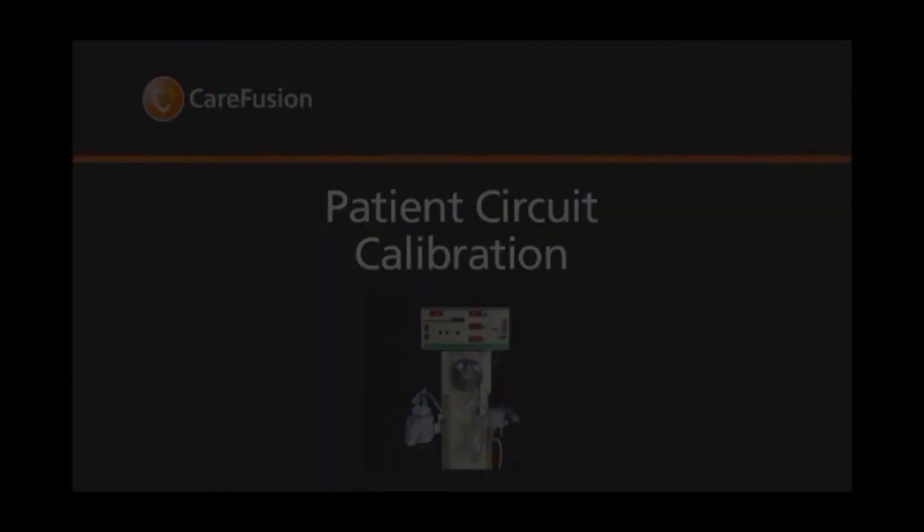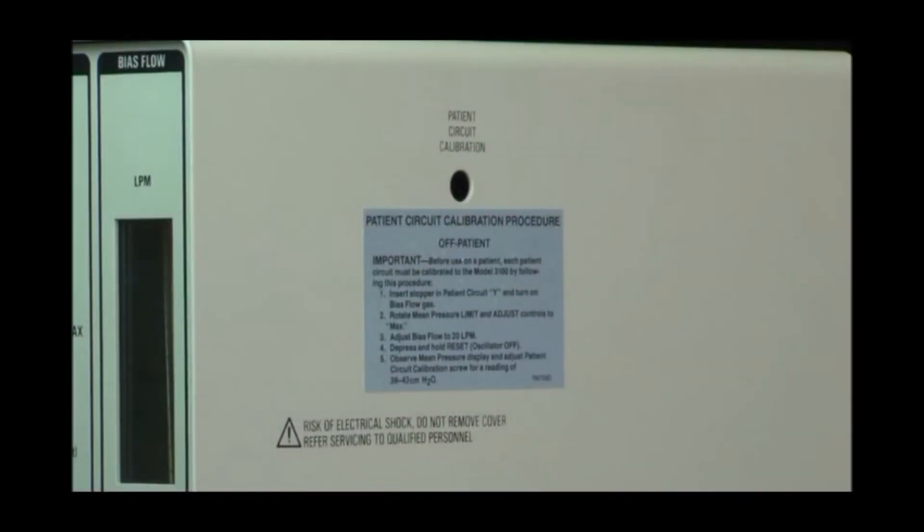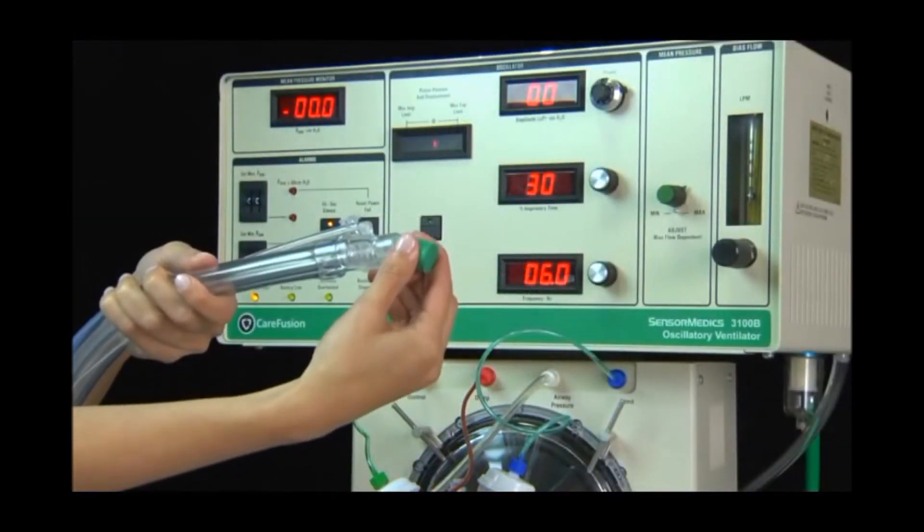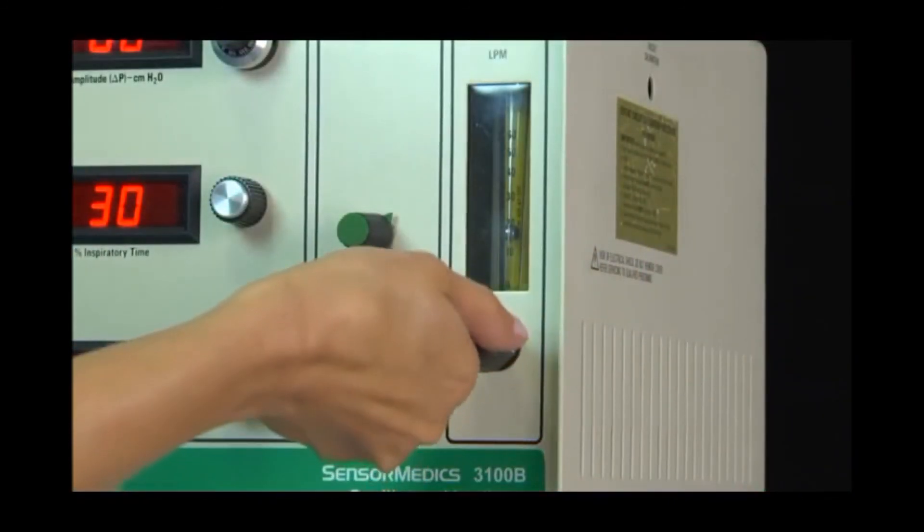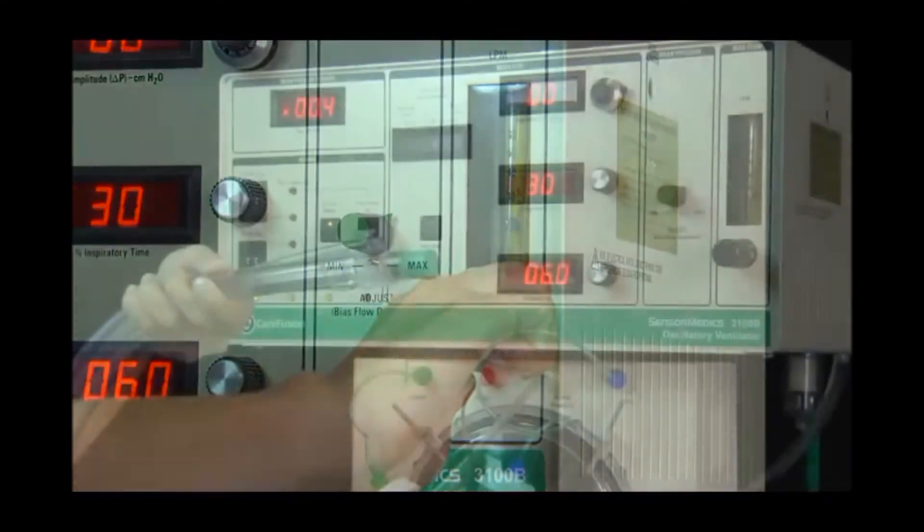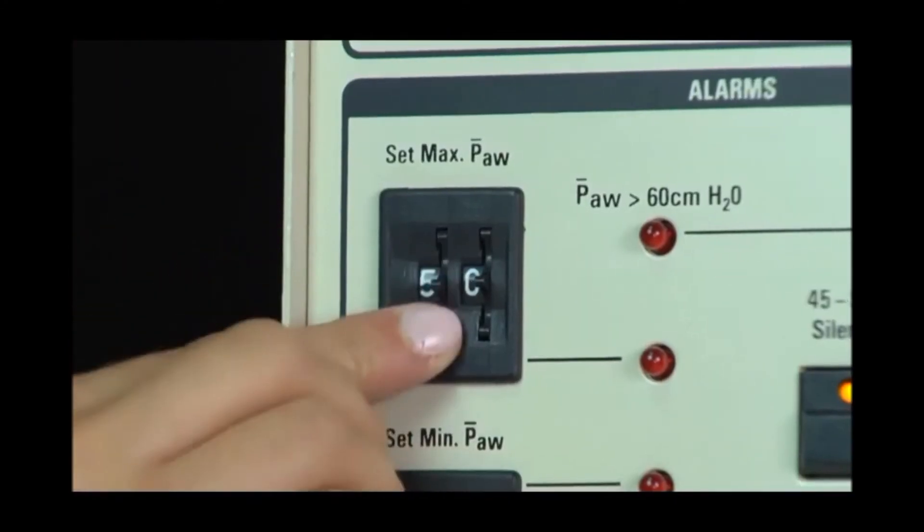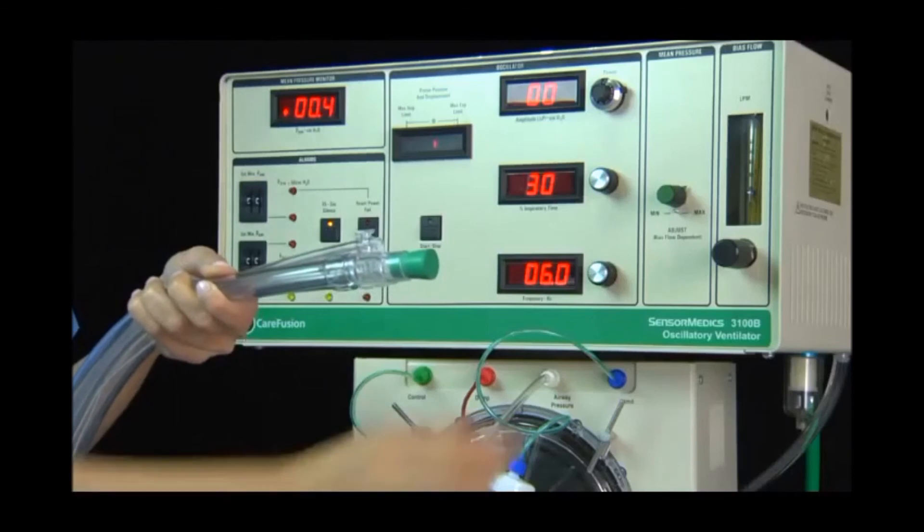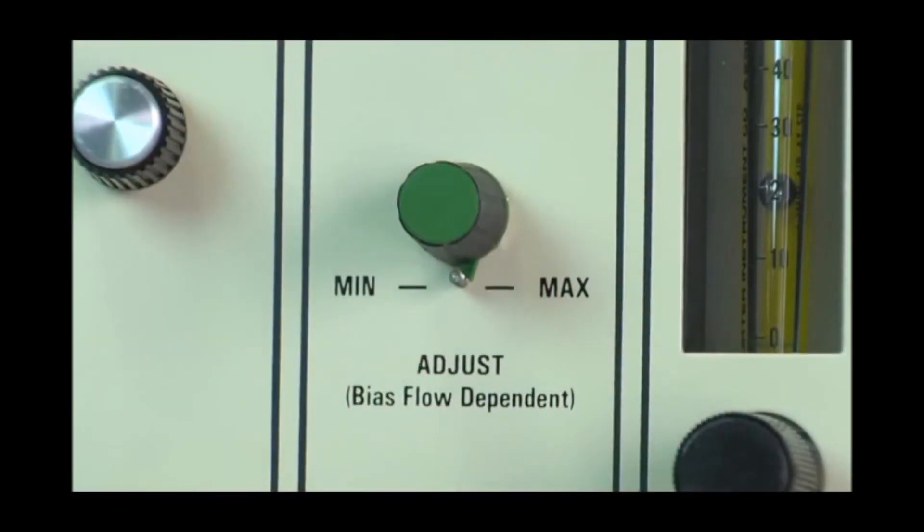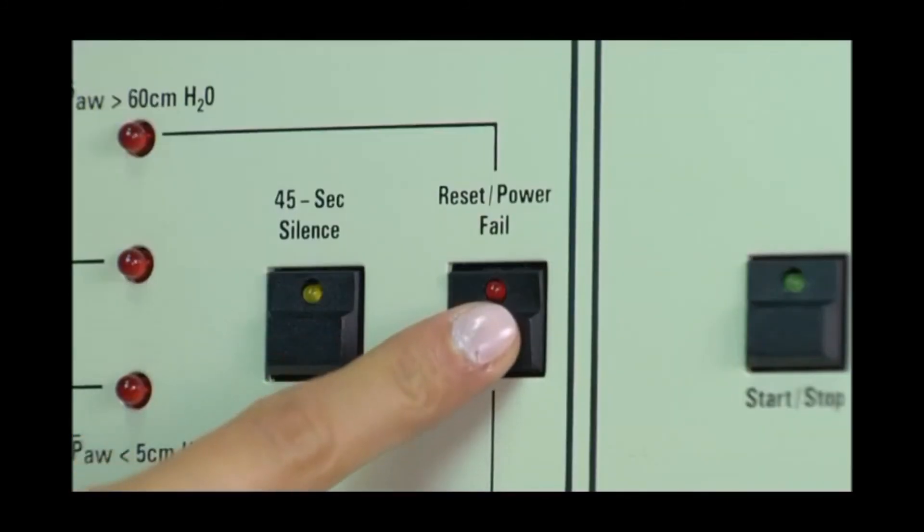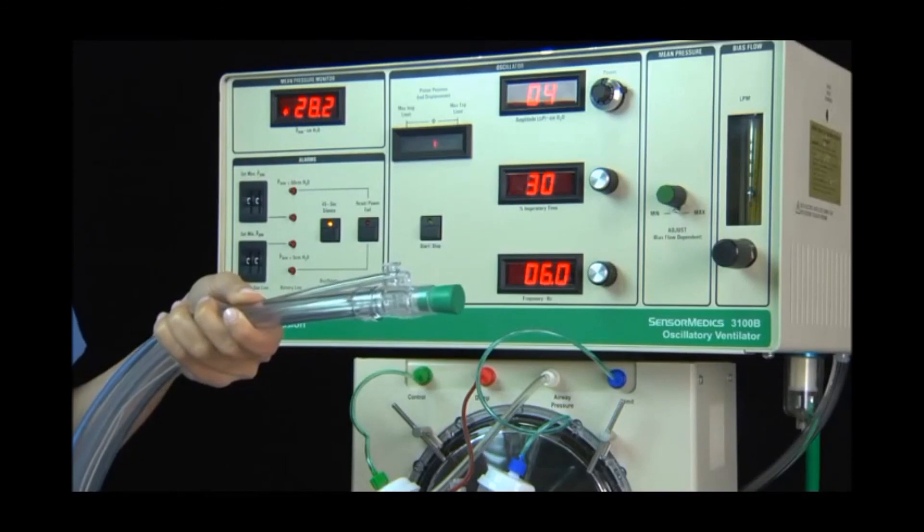To calibrate the patient circuit, locate the instruction label on the right side of the ventilator and follow these steps. Insert the stopper into the patient Y and adjust bias flow to 20 liters per minute. Set the maximum mean airway pressure alarm to the upper limit. Set the mean pressure adjust to the maximum setting by turning the control fully clockwise. Press and hold the reset power fail button until the mean airway pressure reaches 5 centimeters of water pressure.